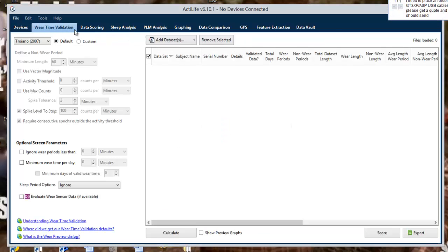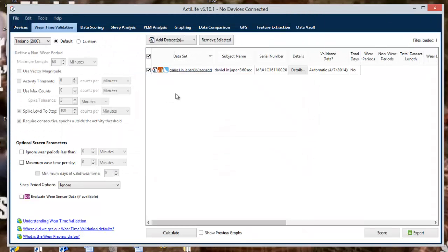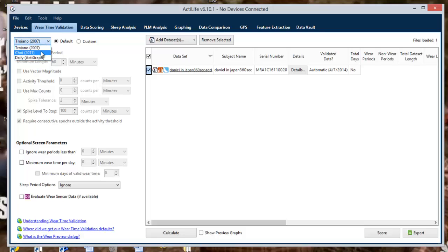You will then need to add a data set. After your data set has been added, you need to ensure that the check box to the left of the data set is selected. Next, you will then need to select a wear time algorithm. You can do so by selecting the scroll down bar in the top left corner.